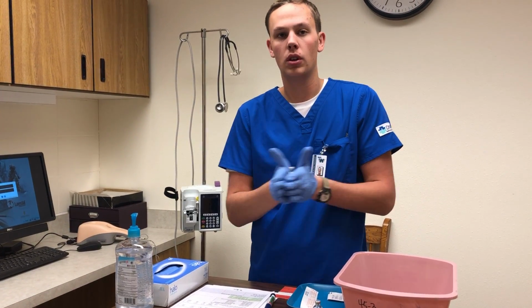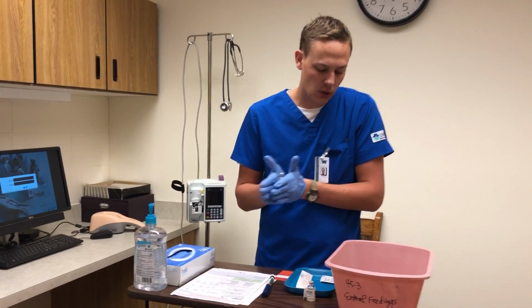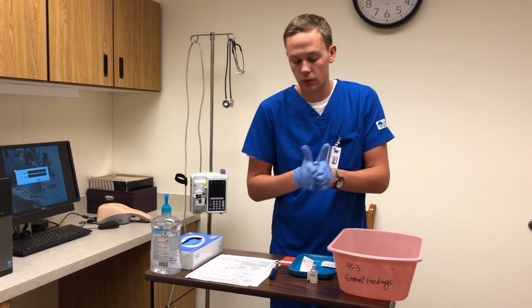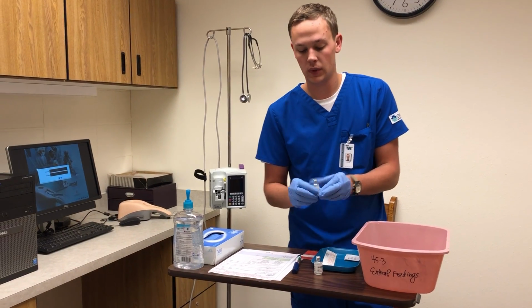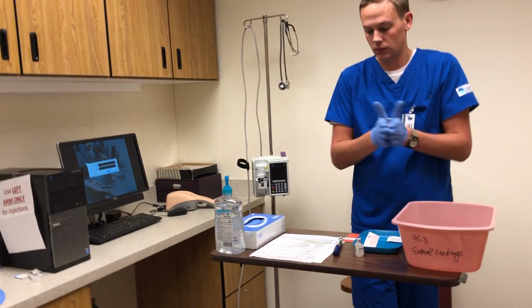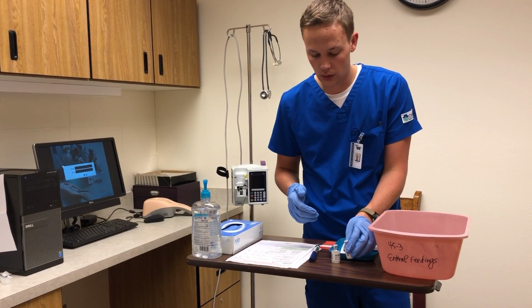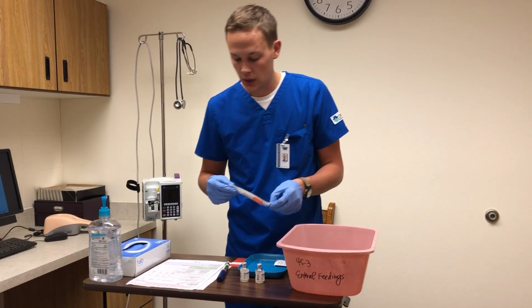Because I forgot to mix them, I would have to sterilize them with an alcohol prep. I don't know if I have enough alcohol pads in here with me, so just know in a clinical setting I would do that. I would wipe them down after mixing them. Okay, so those are mixed, and again, like I said, I would re-wipe them down.